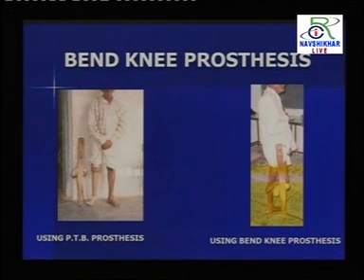But once the expertise is there, then we can give them expert advice also to make them look like a normal person, because this is only for the cosmetic purpose you can see. The function was he was able to walk with that also, but in the regular prosthesis he was given a natural look also with the normal prosthesis.